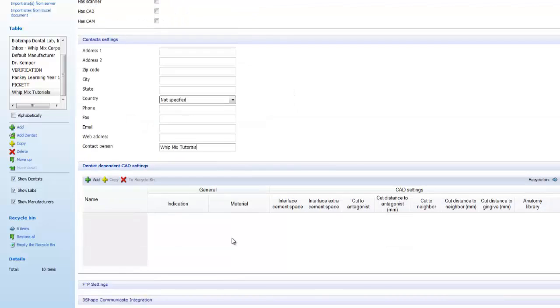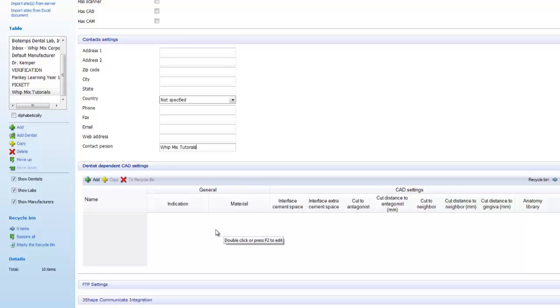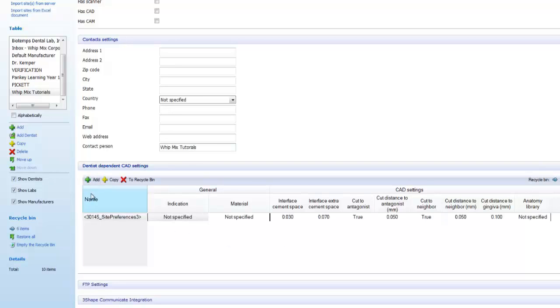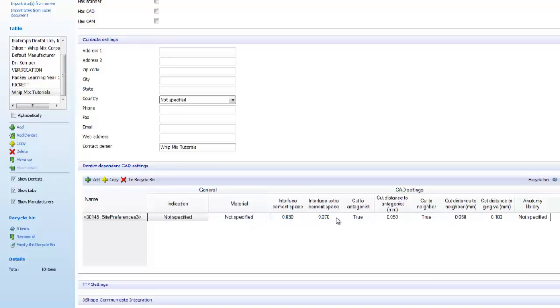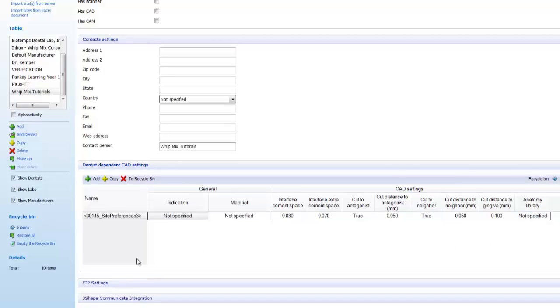After we've filled in all the information we want into the contact settings, we have the option to add dentist dependent CAD settings. If we click the add button, it will create a new setting. Inside the new setting, we can specify what setting the doctor likes in his designs. And 3Shape will enforce those settings on the doctor's cases. We can edit any of those settings by double clicking in the box we want to change.